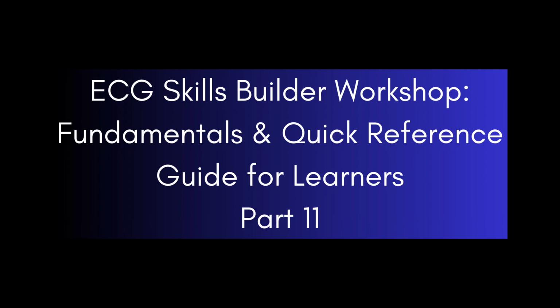Welcome back to my ECG Skills Builder Workshop, where I will be covering all of the fundamental knowledge and skills you will need to read and interpret an ECG in a quick and effective manner. This will be part 11 of my multi-part video series of doing so. Without any further delay, let's go ahead and get started on today's content.